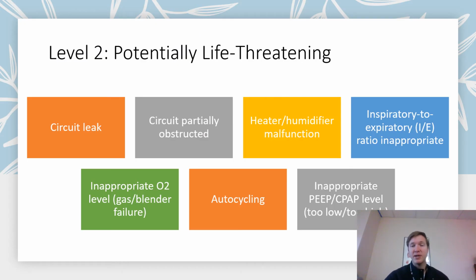Other things too, potentially. So this is our second level. The one was life-threatening. This one's potentially life-threatening. So hopefully you're making a little mental list. You're like, oh, this one's only potentially life-threatening. It sounds like that's something I could ask you about. Which of the following would be potentially life-threatening? Which ones are immediately life-threatening? So make that list. Make sure you make that distinction in your studies.